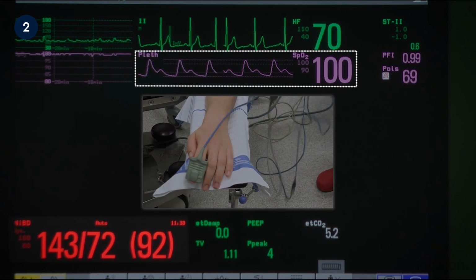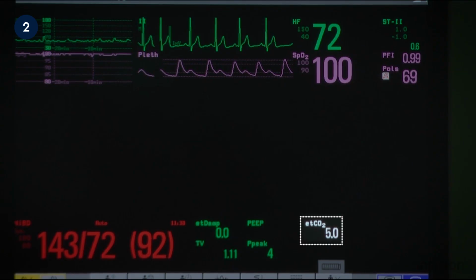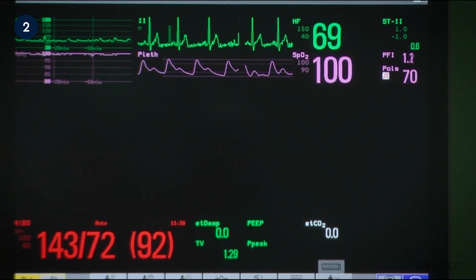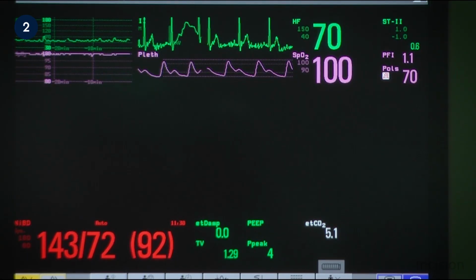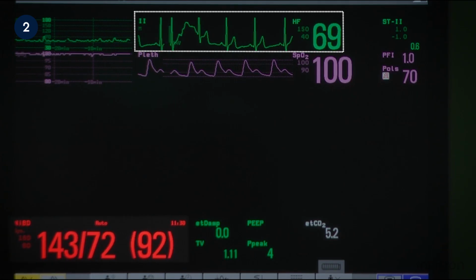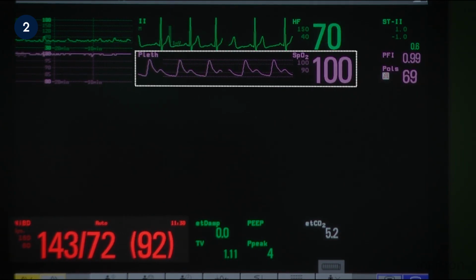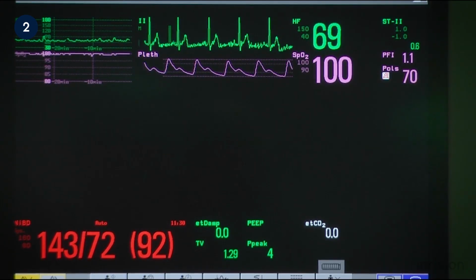Because of potential respiratory complications, some anaesthetists monitor end-tidal CO2 routinely. In the first 5 to 15 minutes of a spinal block, monitoring is essential. In this period, each of the previously mentioned parameters should be checked every 5 minutes to ensure the patient has not developed a high or total spinal anesthetic.